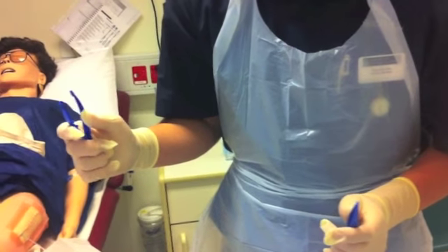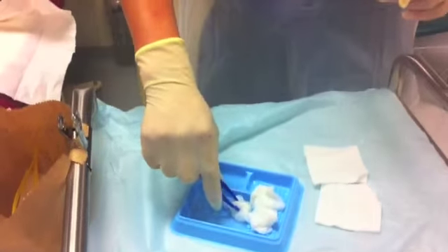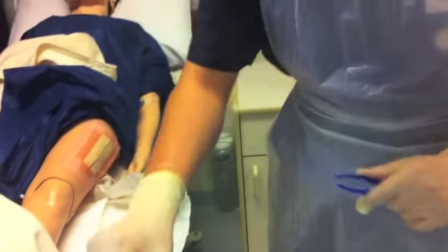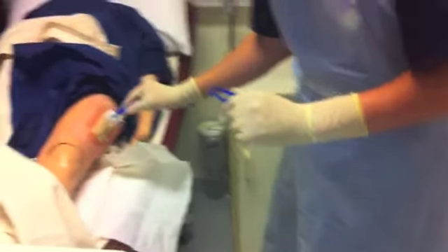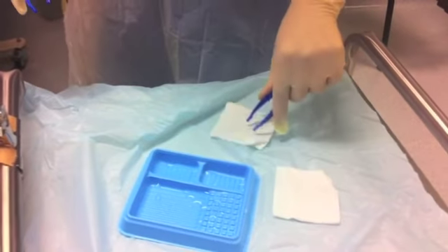Forceps. The other pair of forceps, which is the dirty pair, is used to clean the wound. I clean the drain site from least contamination. And dry it.